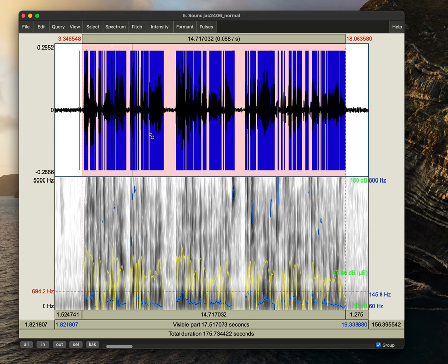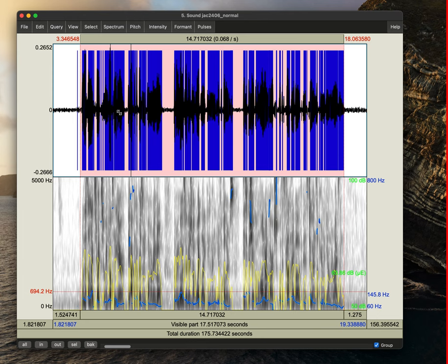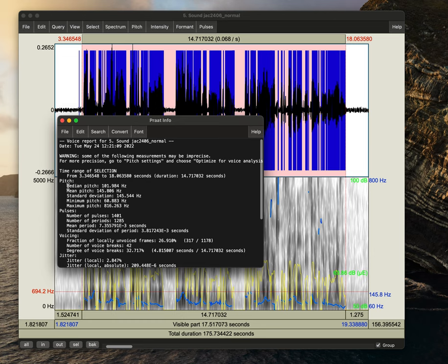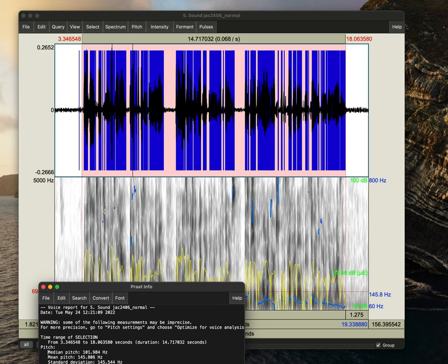The next three measures. I'm sorry. The next two measures will obtain for connected speech is our mean pitch and our standard deviation of pitch or pitch variability. So to do this, we would have our highlighted measure. We would then go to pulses, voice report. We'd want to take our mean or median pitch.